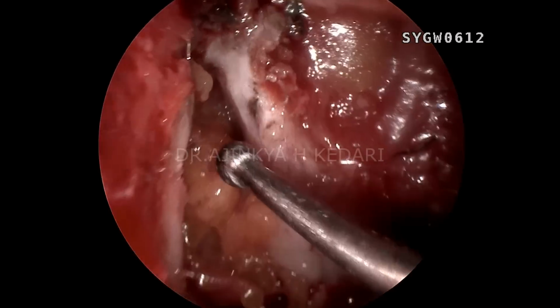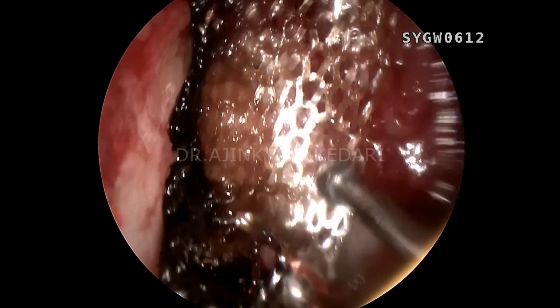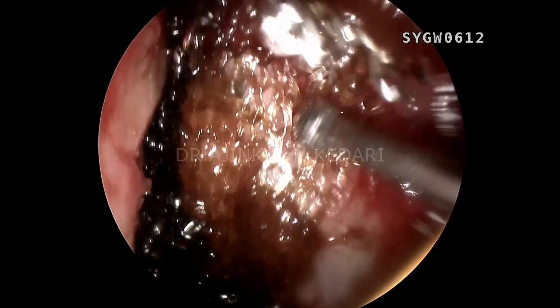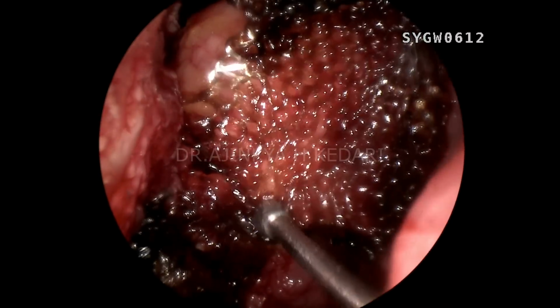So you can see multiple fat layers up there, and then a layer of Surgicel to induce fibrosis and extra additional support for that fat. And over this, I'm going to put a layer of tissue glue.